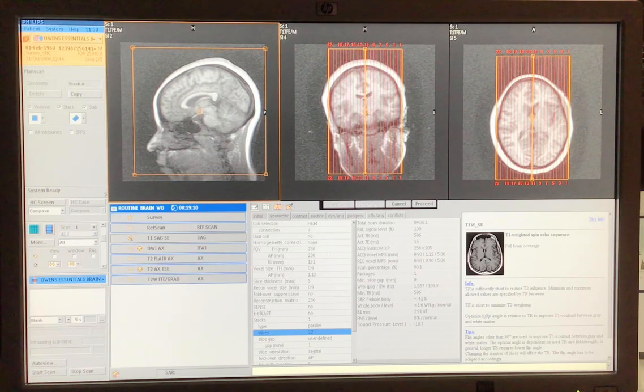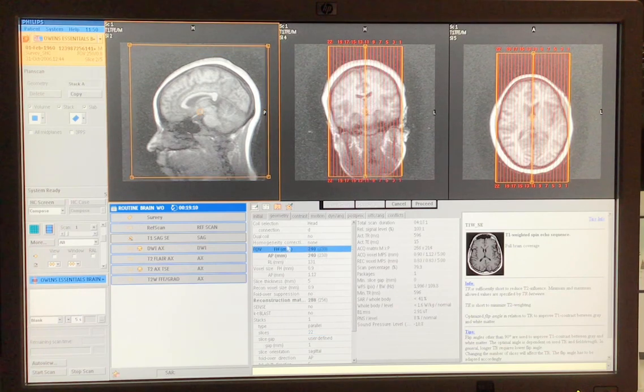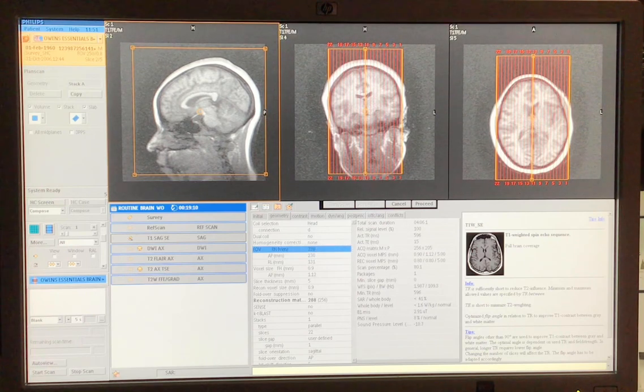So I'm telling you to do a 240 by 240. So I'm going to plug in 240 by 240. This is the field of view that I want to use, okay? Now, on this particular patient, because everybody's head size is different, right? And I'm making it easy for you as far as telling you what to plug in. Could you have used a 230 by 230 on this particular patient? Is there any head anatomy outside of the field of view that we're missing? No. You could have used a 230. Could you have used a 190?